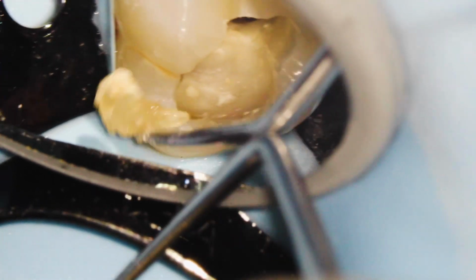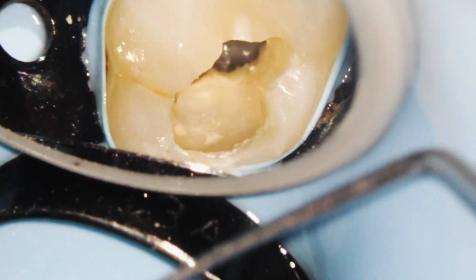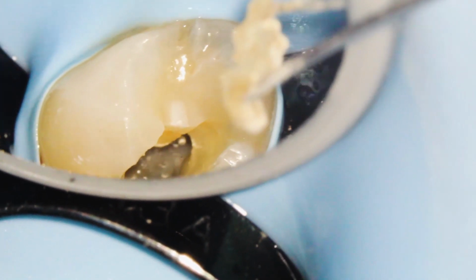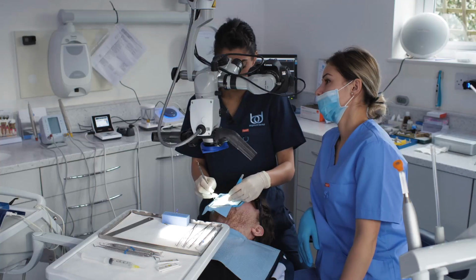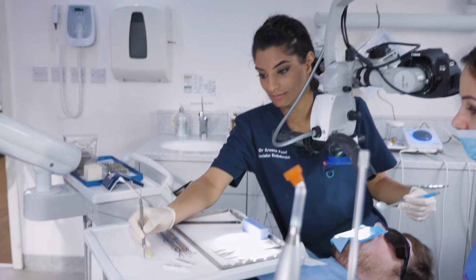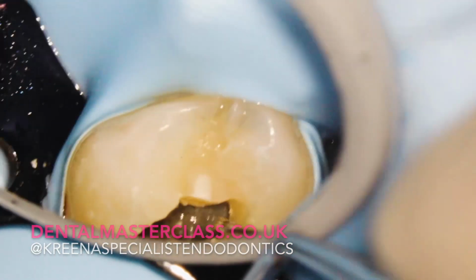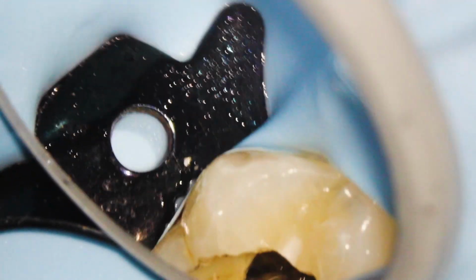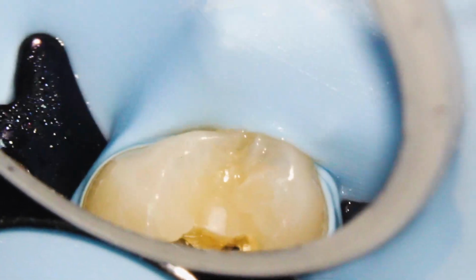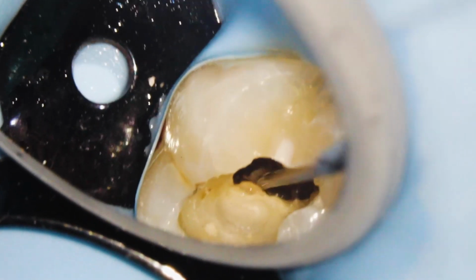So on an X-ray, we could see here, that's the pulp stone. It's quite a large pulp stone in this case. So yeah, from before we can usually tell on the X-ray. We could see here there was calcification in the pulp, so I was expecting there to be something there. It just looks like a slight haziness when we're in there.